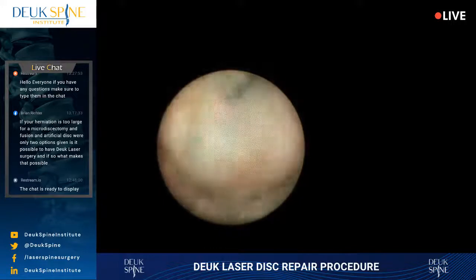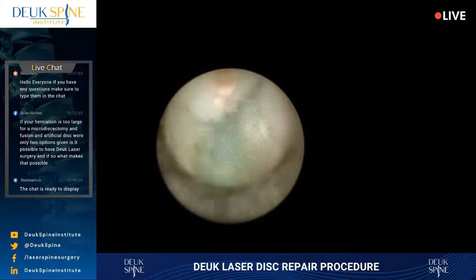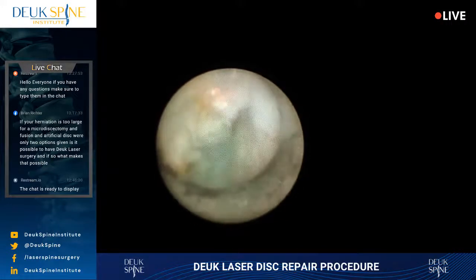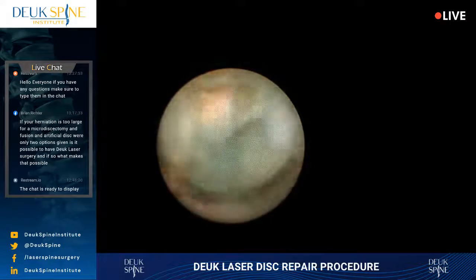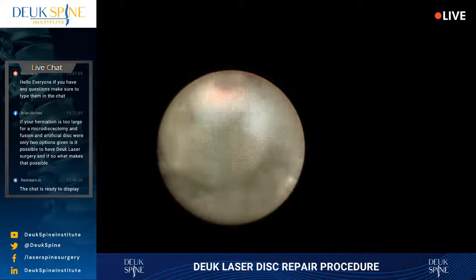And the reason for that is this liquid that we have it in. There's constant irrigation going on in here. That's water, basically. It's saline. There's still another giant herniation right there that I got to deal with. It's literally sitting right on the nerve in the foramen. So I got to debulk it. It's all scar tissue right there. And I got to fish that thing out, either fish it out or break it up into little pieces. To me it doesn't matter, but I like fishing them out better.